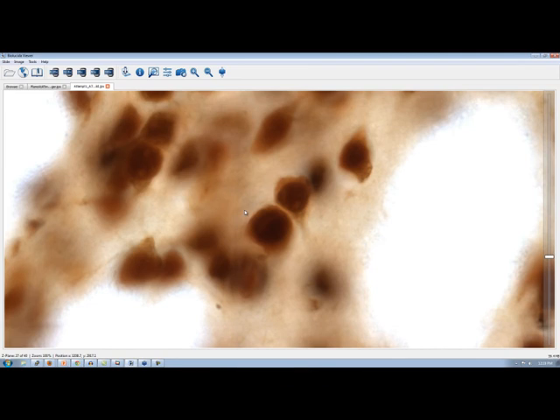Right now, there could be other users looking at this exact image, streaming totally different regions of it. And this image is a really good example of what we were talking about earlier. When you need to move image files from one workstation to another, you're not going to take a 50 gigabyte file and move it on a thumb drive. Absolutely. If you need to share it with someone across the country, you'd have to mail a hard drive. What this allows you to do is have a giant file, but only ever look at small parts of it. Sure. This limits the amount of data that you're looking at. And realistically, even when I'm sitting at the microscope looking at my tissue, I'm not going to look at every last square micron of tissue. Exactly. So you have it available to you just as if this was a real tissue.